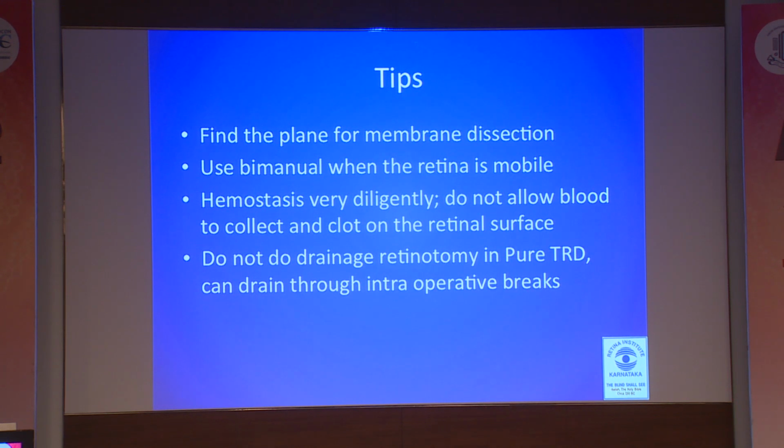Hemostasis on the table should be very diligent. Do not allow large quantities of blood to clot on the retina, because this can get stuck to the retina very badly, and trying to pull it off, you can cause more damage to the retina. That can be really a bane during surgery. So do hemostasis as it happens, and do not allow clots to collect on the retina.